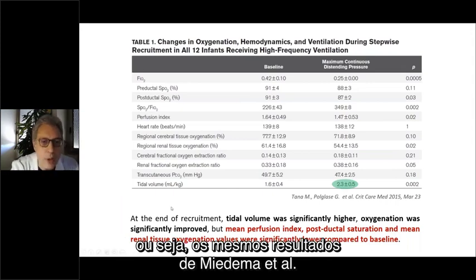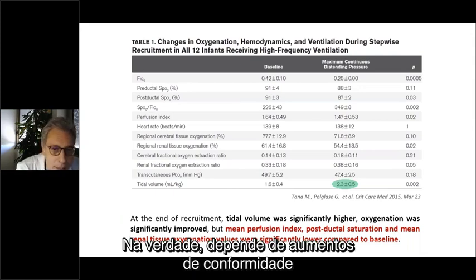That is the same result as Miedema et al. And in effect, it depends on the increase of compliance.